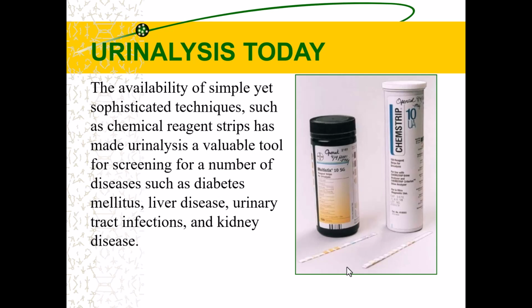A lot of labs, even their big instruments, are still based on strip technology. It's easy, it's a waived test, meaning anybody can do it. So we have our lab assistants and our phlebotomists and test specimen processors that are able to actually do these tests. What does it mean to be waived? What's a waived test? It's very hard to mess up. Very hard to mess up. Yep, it has to be very simple. Remember the criteria? Anybody's allowed to do it.